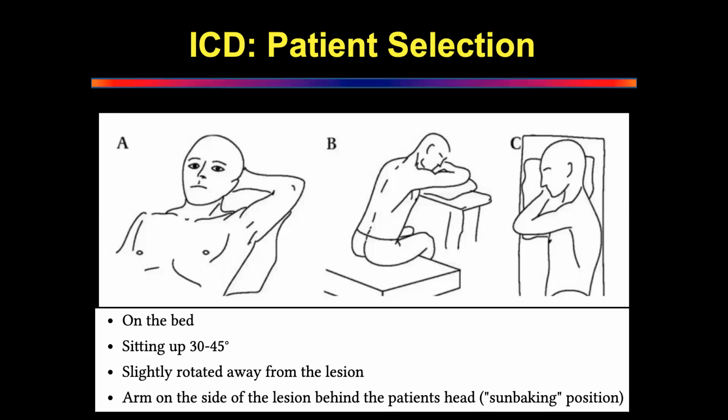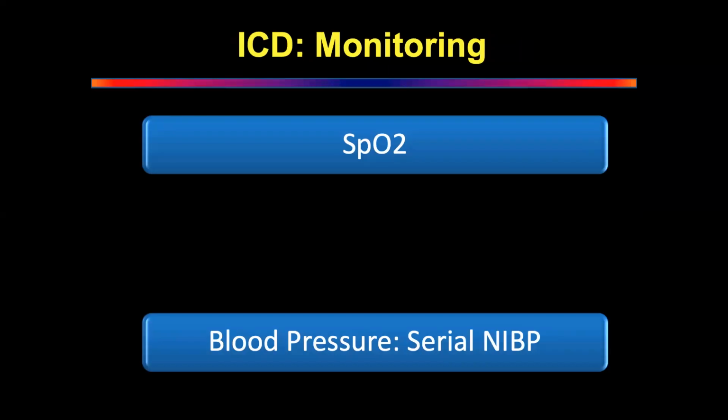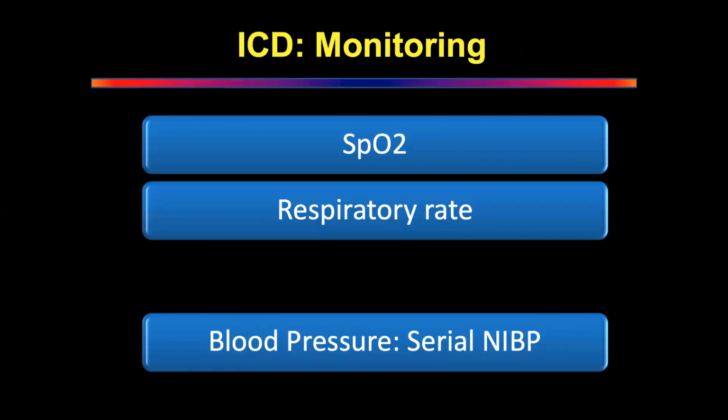How do you monitor this patient? We need to have at least pulse oximeter and ECG attached. ECG and BP. Anything else you want to do? Blood pressure monitor, non-invasive BP. Peripheral IV cannulation.